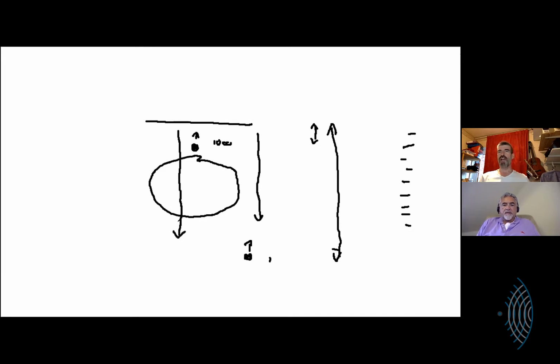You're losing every tiny boundary. You lose almost 1% of the signal potentially, or something like that. And there are lots of boundaries in the body. So when you get a fluid, it goes through much stronger. And so this area behind the cyst will be bright. And that's the enhancement artifact that you learnt about.